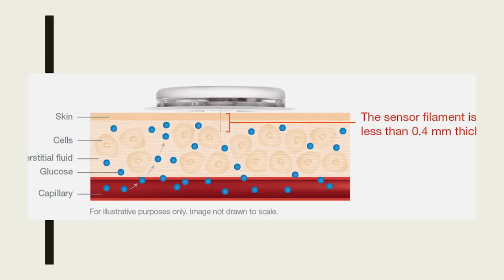My clinical experience has been that patients feel so enlightened and secure after having one of these sensors, able to know what their blood sugar is whenever they want without having to stop and prick their finger. So we've been very impressed with these. Again, all of these are measuring glucose in the interstitial fluid. When somebody draws your blood in the hospital, they measure it from the vein. When we prick our finger, we measure it from the capillary. So not all of these compartments are always the same. If everything's nice and steady, then they're generally the same. But if things aren't perfectly steady, these systems don't all change at the same rate.